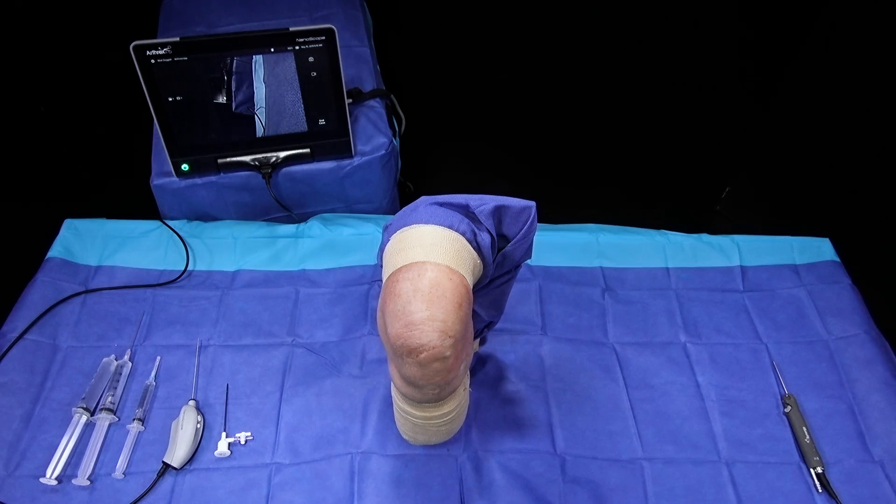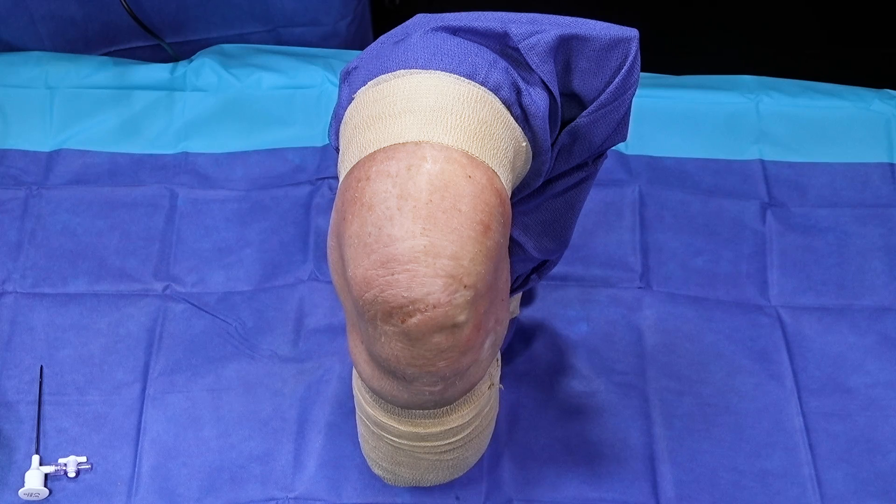Before the procedure starts, I'll often talk to the patient and ask how much they want to be a part of this process. They can oftentimes visualize the nanoarthroscopy tablet at the same time I am. I'll see how much they feel comfortable seeing the pathology that is in their knee and also being a part of the overall experience.